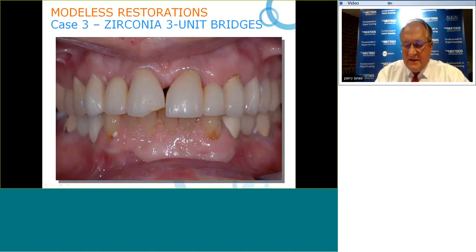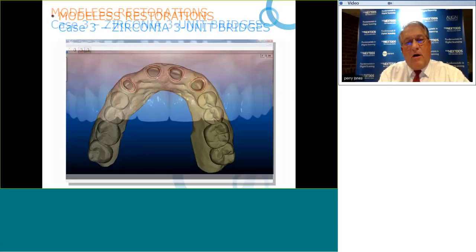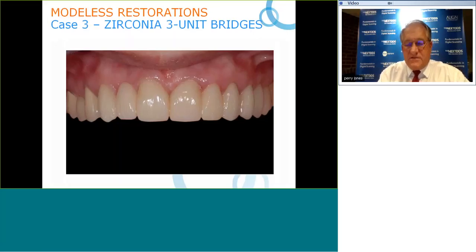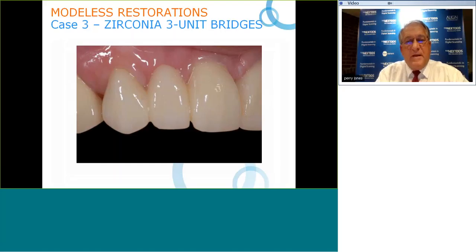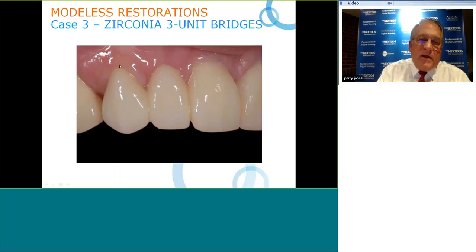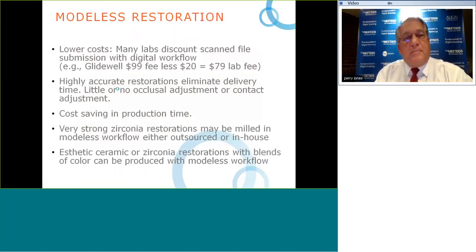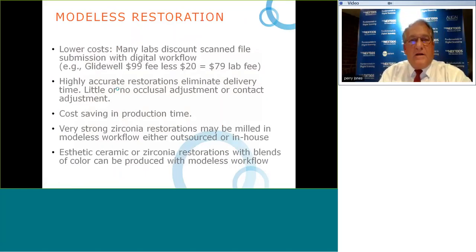This is a highly aesthetic case with minimal preps, margins marked, and restorations placed. Looking closely at the close-up, you can see how well adapted the zirconia is to the margins and how the blend of zirconia makes a very nice restoration.